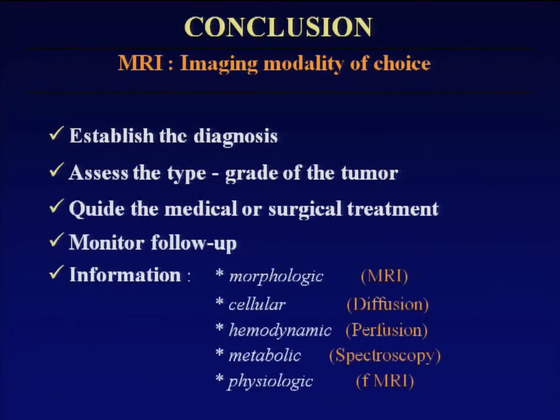Nowadays, the radiological diagnosis is not strictly just to detect, to identify a tumor. We can give information about, of course, the morphology, but also the composition of the tumor, the hemodynamics, the metabolism, and the physiology.